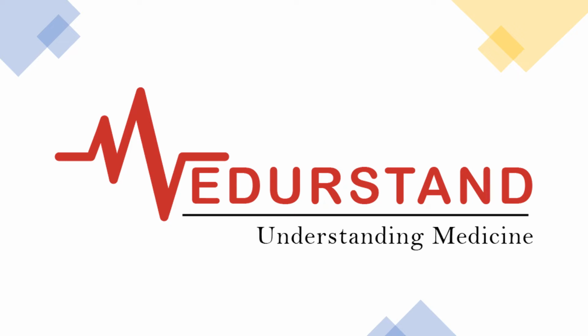Medurstand Understanding Medicine. I'm Professor Azizur Rahman, and we have covered atrial enlargement in the last video, and today we're going to talk about ventricular hypertrophy. Before we discuss ECG criteria of left ventricular hypertrophy and right ventricular hypertrophy, I must say that this remains a poor, very insensitive and not very specific criteria for the diagnosis.